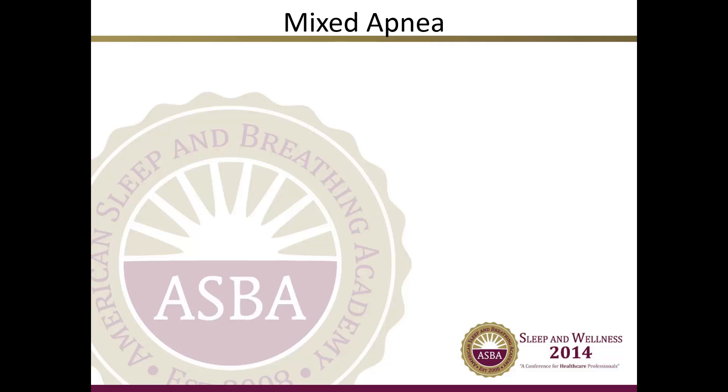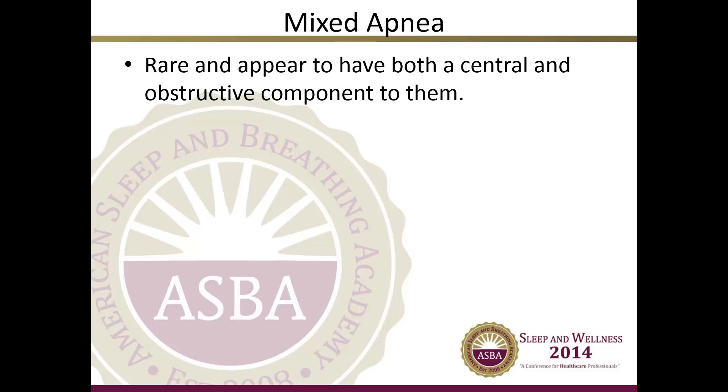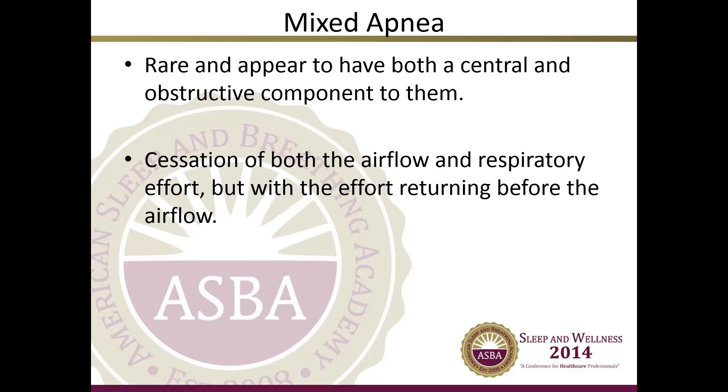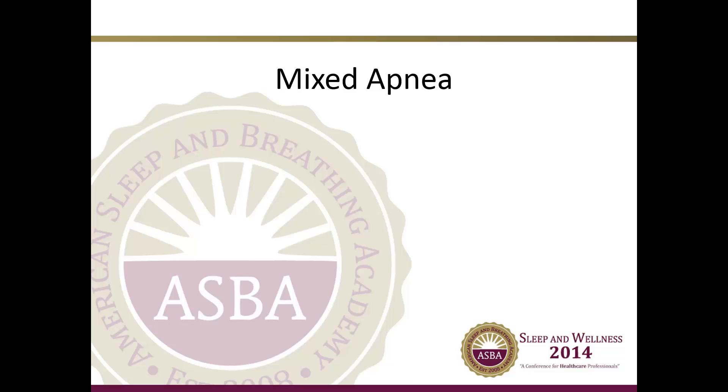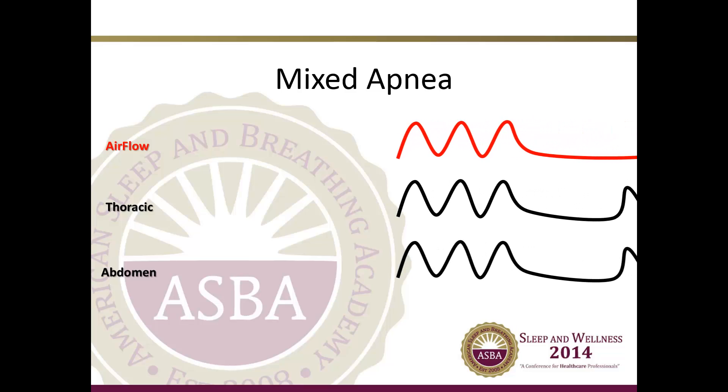In a mixed apnea — which is rare — there appear to be both central and obstructive components. Mixed apneas are identified as a cessation of both the airflow and respiratory effort, but with the effort returning before the airflow. Mixed apneas are usually predominantly central or predominantly obstructive. Here is a mixed apnea — you will see the airflow, the thoracic, and the abdomen effort.